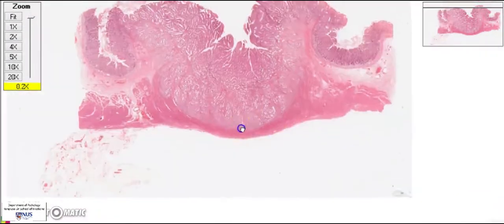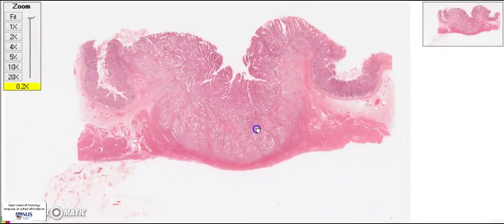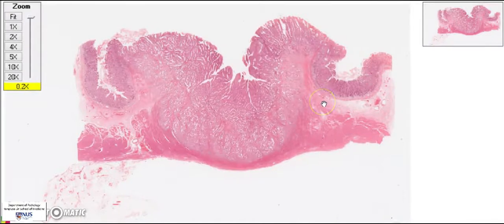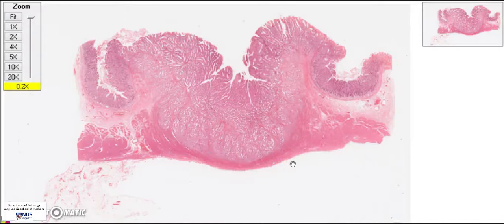So the complete diagnosis here would be: gastric adenocarcinoma, intestinal type, moderately differentiated, and pT2 — where 'p' stands for pathological.